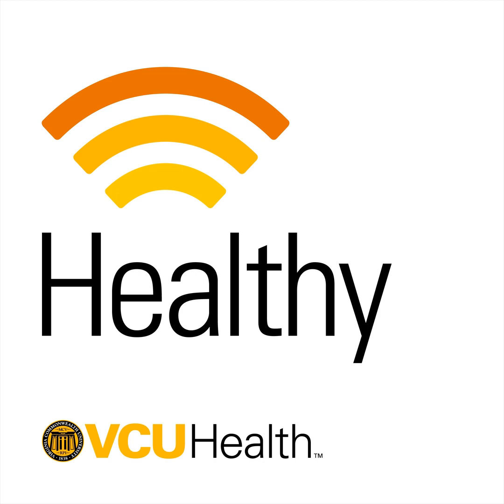But then several decades ago, the technology for developing batteries and small chips and being able to hold them in robust enough hardware that they can be implanted in the body was developed. And this led to deep brain stimulation, which is currently the gold standard for treatment of essential tremor. And instead of making a hole in the brain, we now place an electrode in that same spot. And then the tip of that electrode delivers high frequency electricity, and that electricity disrupts that same circuit.